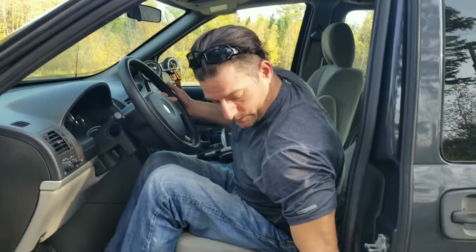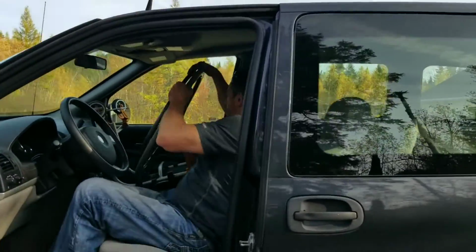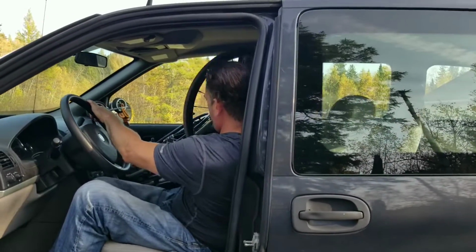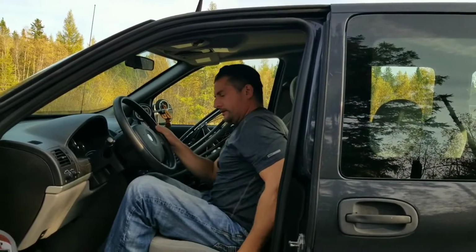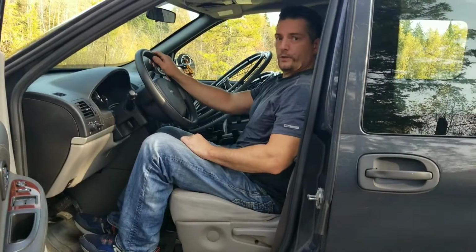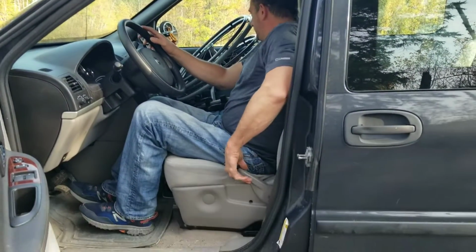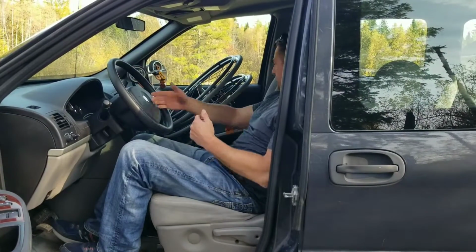Now I can grab this other wheel. I can bring it over. I can even sit it right in there if I like. You can even bring your other wheel up, sit it in there. There you go, ready to go. Now to get out, same thing, you want to get your seat rest back. Give you lots of clearance here.